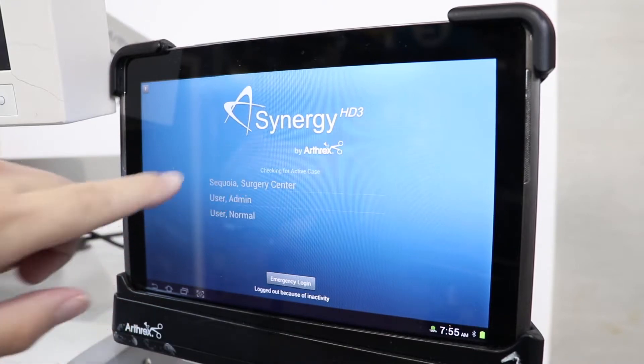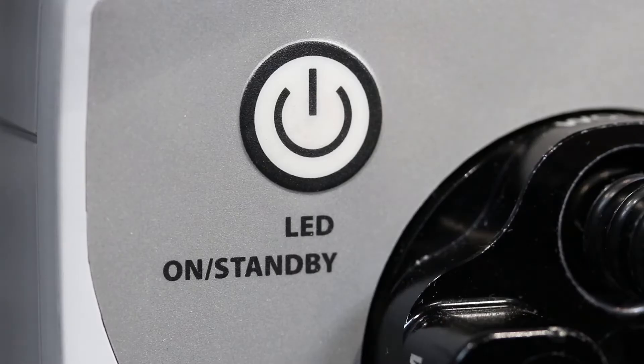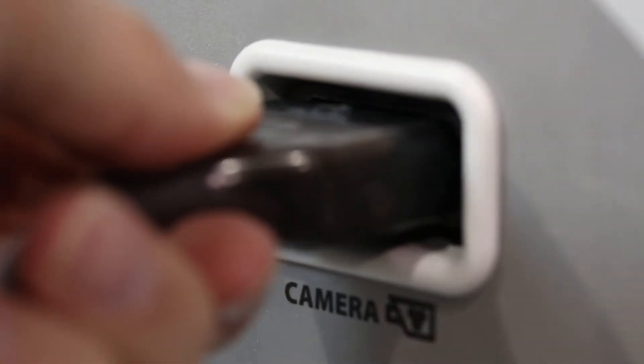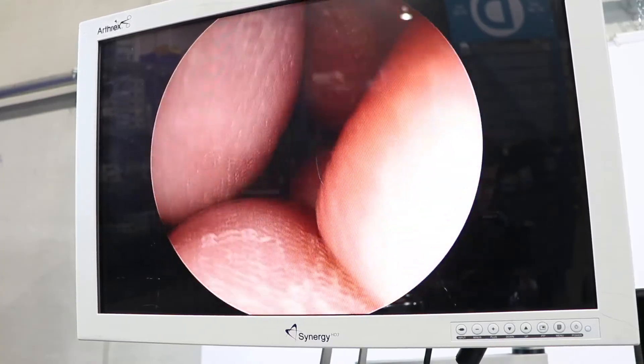To start up the system, you would want to plug the light cable into the outlet and take the light off standby. Then, with the up arrow pointed up, you would want to plug it into the unit. Once it's plugged into the unit, you're going to receive a picture.